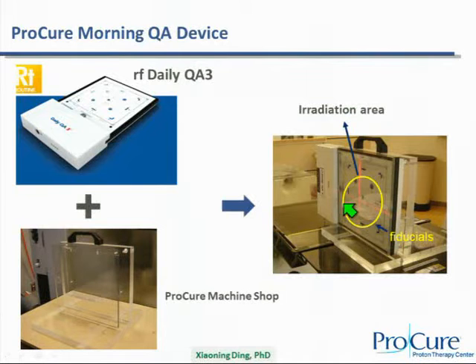The RTTs carry the whole thing, put it in the table in the same position every day, irradiate a single beam, and remember all these tricks we talked about, how we add build-up so that we can maximize the use of the single beam. If you use any aperture, like the 10 cm aperture, it will be wide enough to cover 5 different ion chambers here, the central one for output and the other 4 for symmetry and flatness. Each one of those detectors that is used for morning QA warm-up in photon therapy already has some build-up, so that helps.